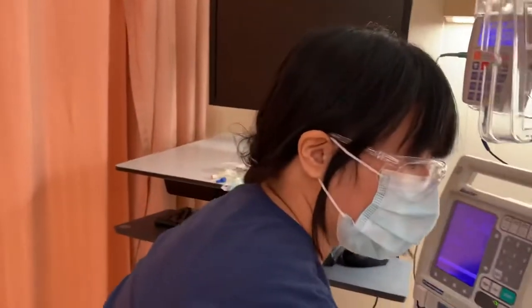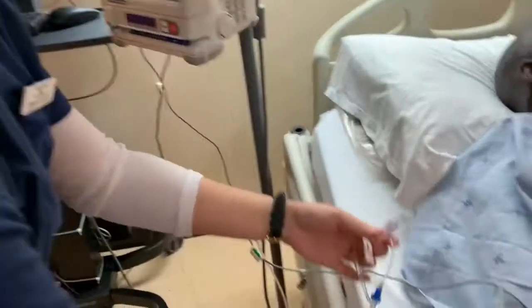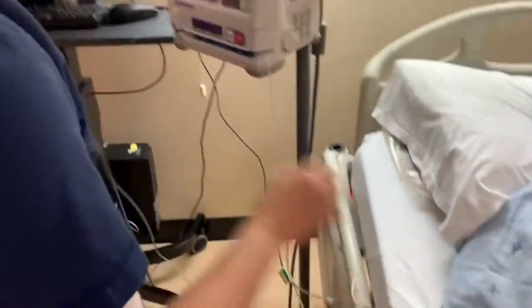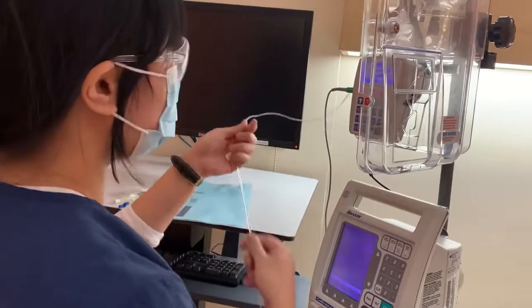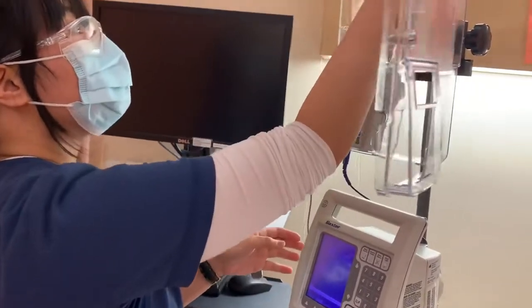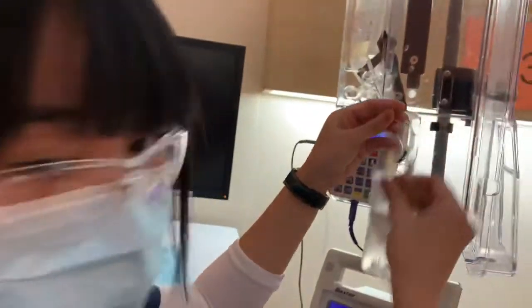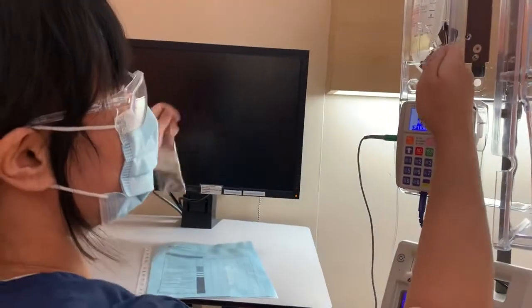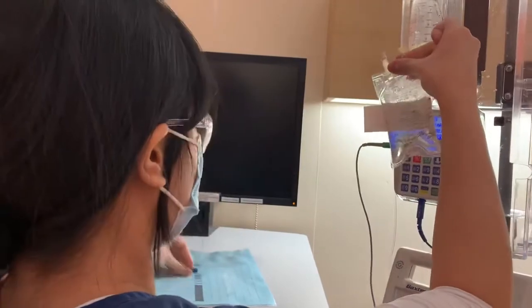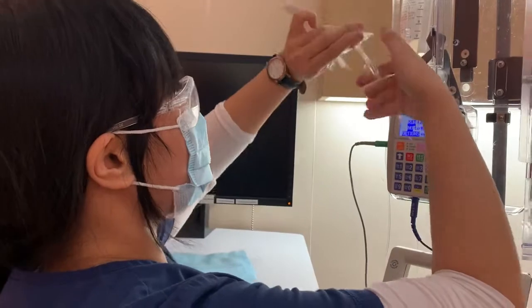And I'm going to wash my hands again. Now I'm just going to make sure that it is connected to the patient. And this line is also unclamped for now. Okay, and it's connected right here as well. And we're using a no-port tubing and the micro tubing for this Curlin. So, just gonna change this while maintaining sterility. Okay, so this goes to the garbage. And I'm holding it like this so that it doesn't touch anything else. While maintaining sterility, I'm just gonna spike the bag. And I'm gonna hang it.